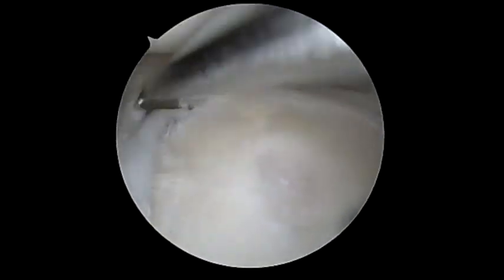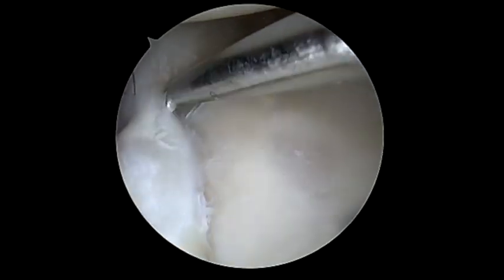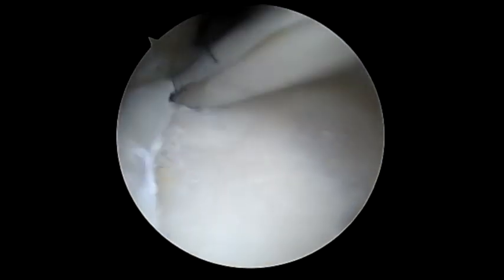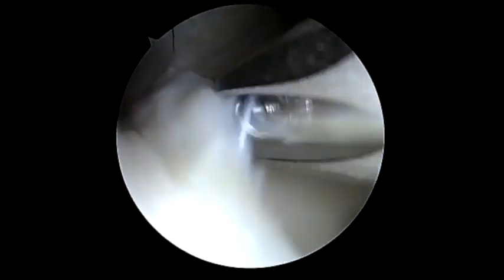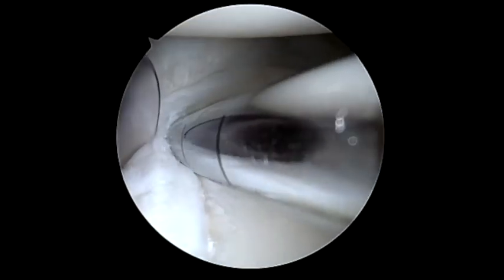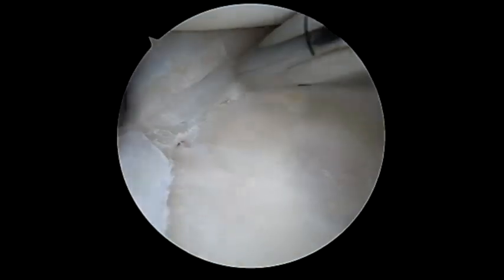You can see here we're in the lateral position and we're elevating off the posterior labral tear in this patient. This can be an excellent technique for some of our baseball players in which we don't want to have a large capsular plication, to reduce the chances of limiting these patients from returning to throwing.